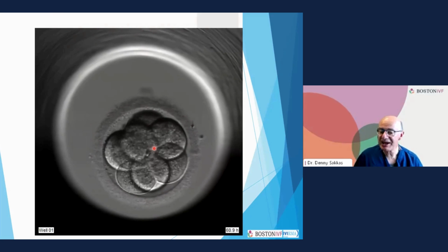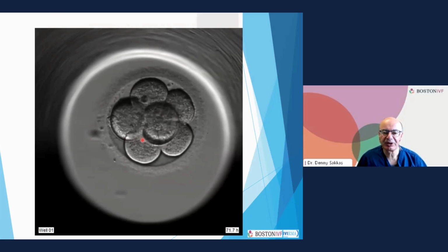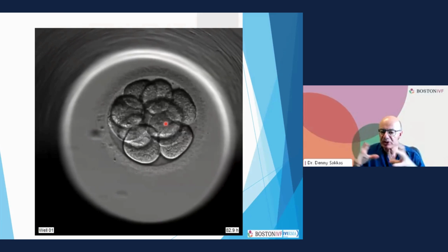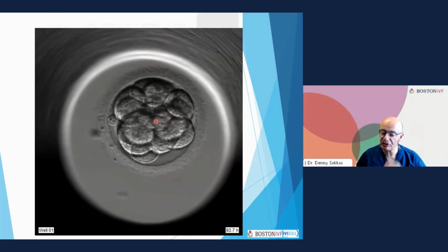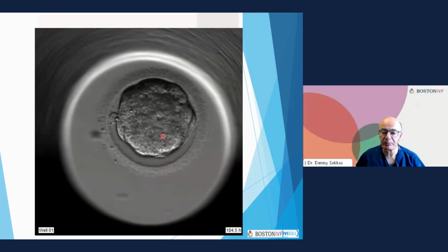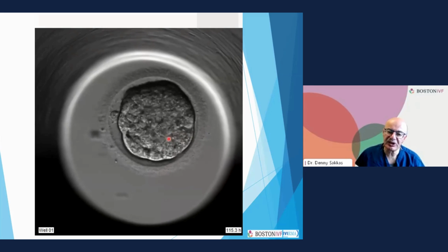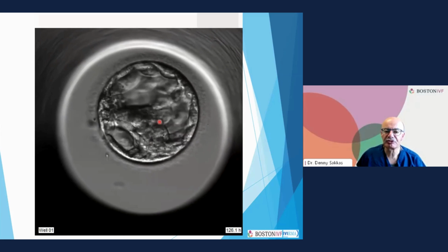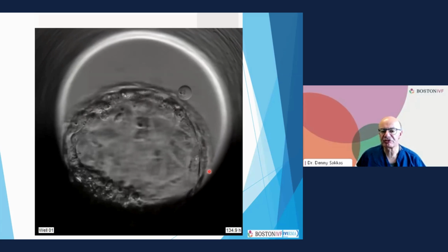So this is a very well-behaved embryo. I wish all of them were like this. You can see that in a few seconds, this 8 cell embryo, these cells will compact and they'll become like a ball. So this is around the 4th day, and then we can't count the cells. So here we start relying on other features to tell us what's a good embryo versus a bad embryo. And you'll see as this embryo develops into a blastocyst, we will start looking at particular features. So you'll see the blastocyst, it'll have a cavity here, and you'll see 2 cells. You'll see some cells here that are more ball-like structures, and you'll see the cells outside here.